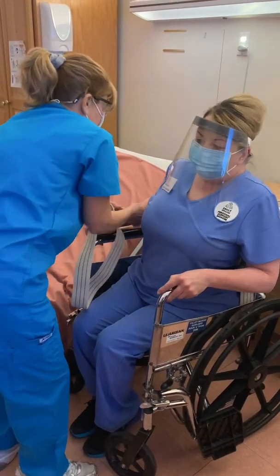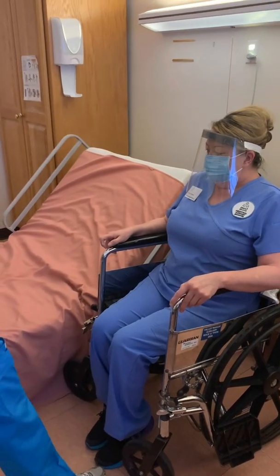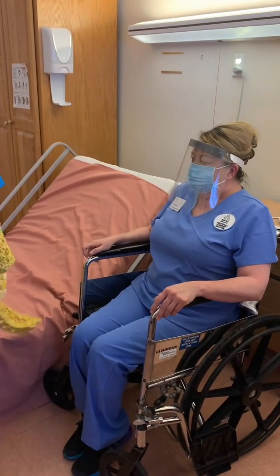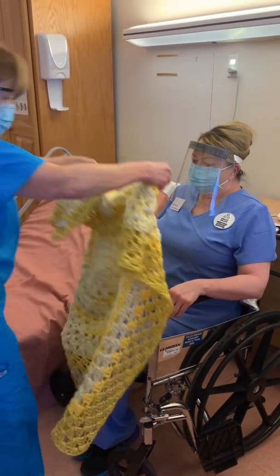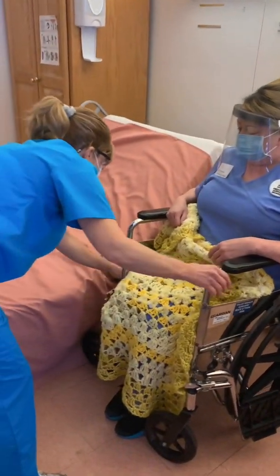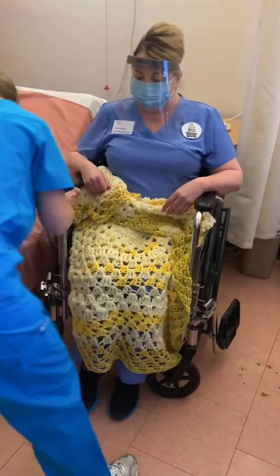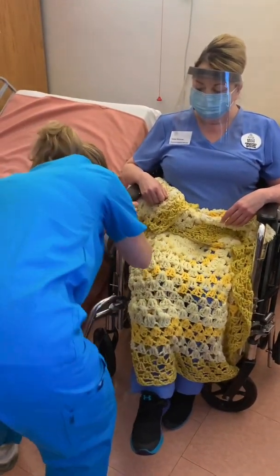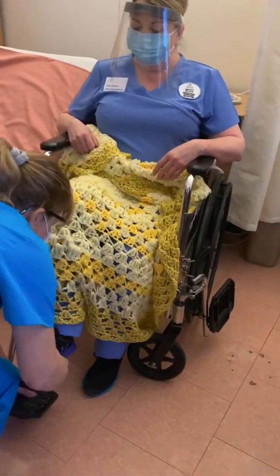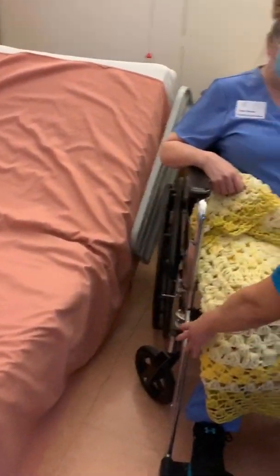I'm going to take this out. Now, would you like me to put the blanket on you before I go? Yes, please. It's chilly. There you go. Now, I'm going to make sure you put your feet up onto the footrests, foot pedals. There we go. Thank you so much. You're helping so much. That's great. Welcome. How does that feel?